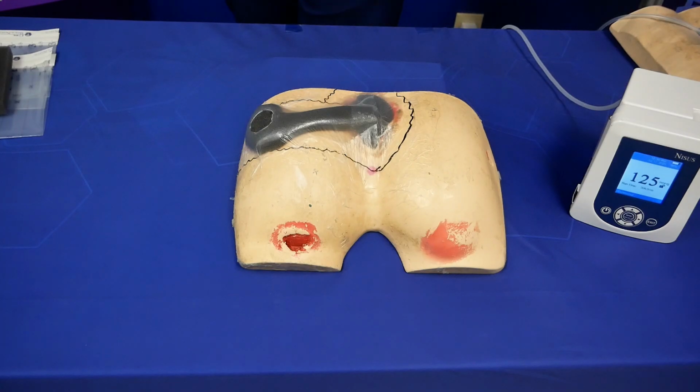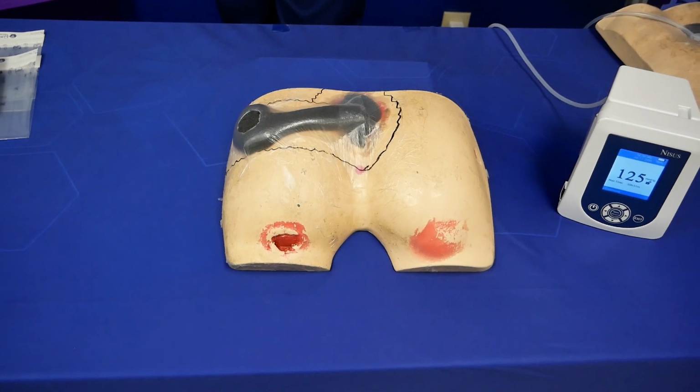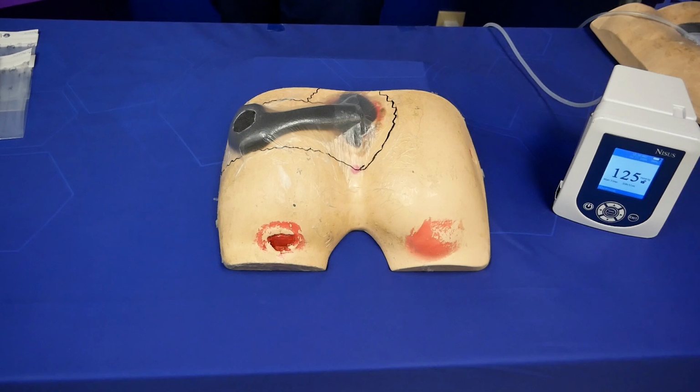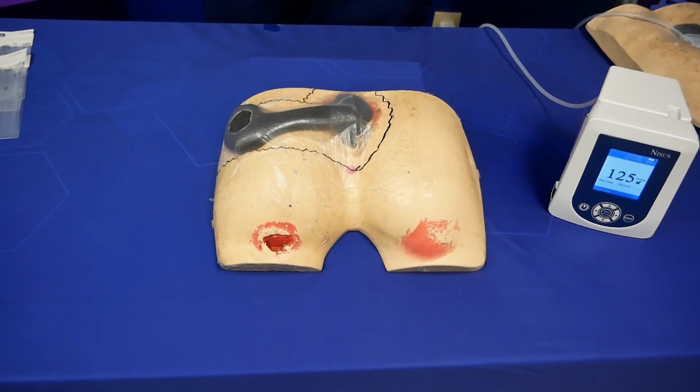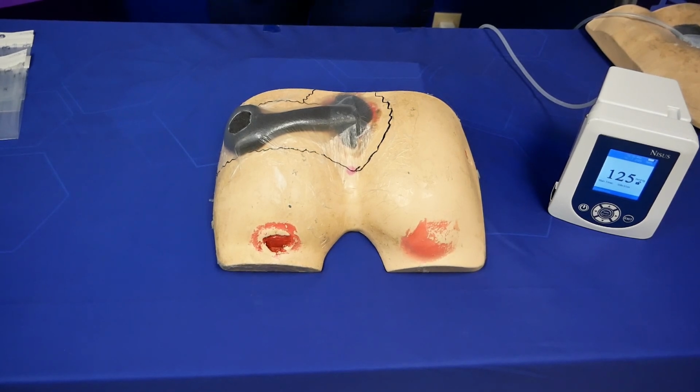So to summarize your general application for negative pressure wound therapy, we're applying that skin prep, followed by the window pane to protect that peri wound, inserting our black foam cut to fit, covering that foam with a piece of drape, then cutting the hole the correct size, which is going to match the same size as the hole under that port pad, approximately 2 centimeters. Once your hole has been cut to the correct size, you then apply the port pad and connect it to your device.